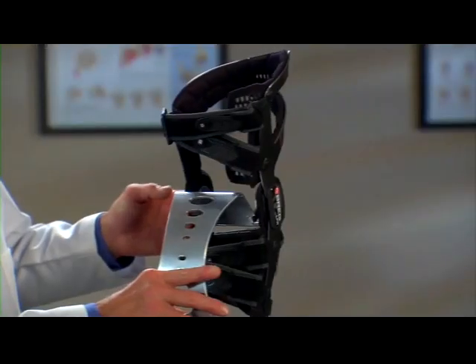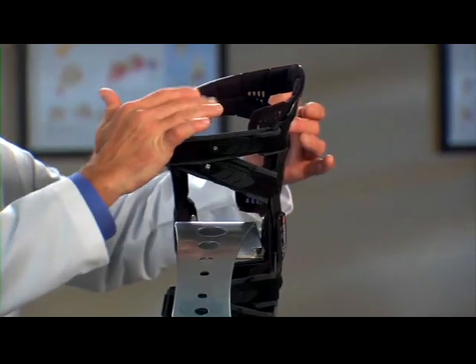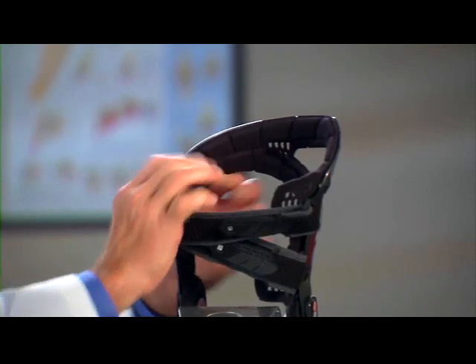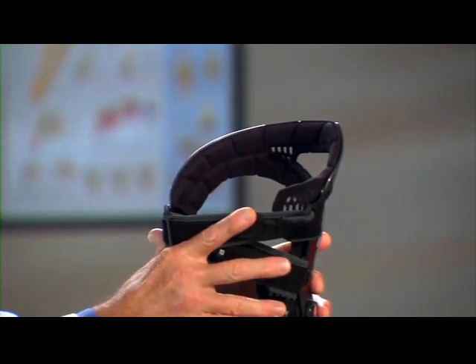Third, the LPR has grooves and ventilation windows cut into the padding. They're designed to move moisture and heat away from your skin, helping you stay cool and comfortable. This padding also grips your leg to help prevent the brace from moving around on your knee.